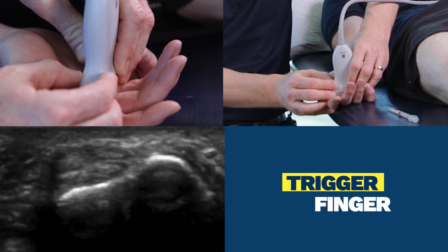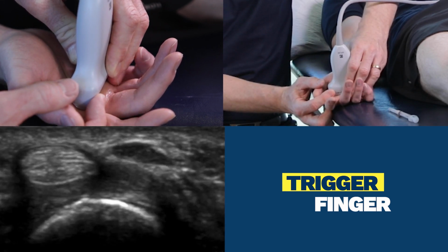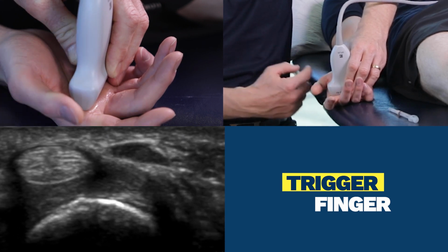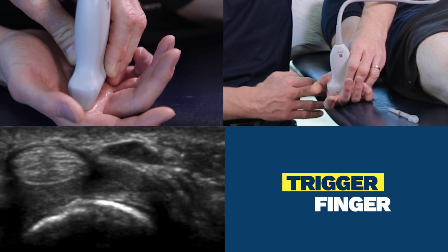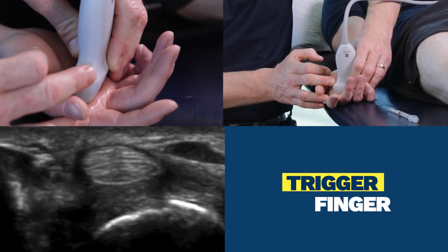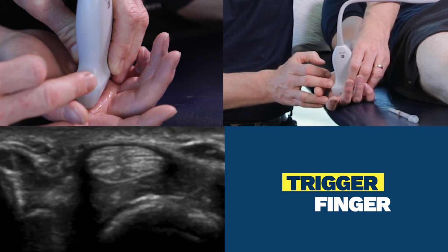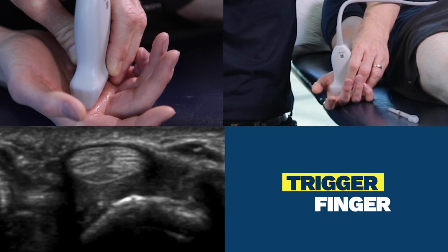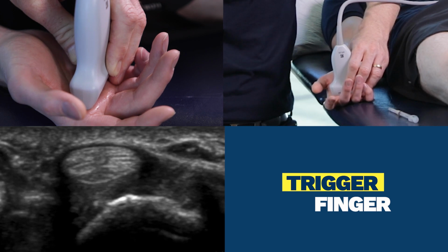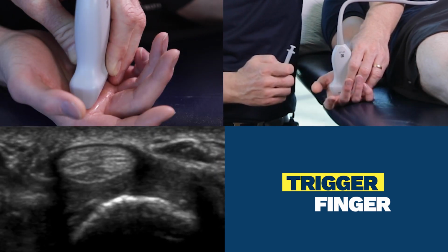And if the movement of the probe is slightly proximal, now we're actually on the distal metacarpal. We'll get that tendon in view in cross section. And here we can see this almost like a black hood, a black veil around the tendon. This is the A1 pulley.